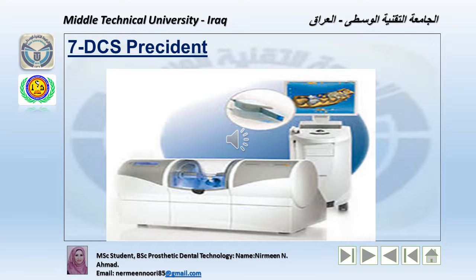In this slide, the last type of the CAD-CAM system is the DCS Precident. The DCS Precident was market launched in 1989. The system is comprised of the Preciscan laser scanner and the Precimill CAM multi-tool milling center. The DCS Dentform software automatically suggests connector size and pontic forms for the bridge. The process center is a dental lab, with an optical scanning machine, custom design CAD program and database, and the CAM process is fully automatic.